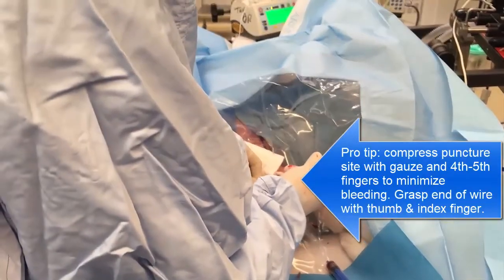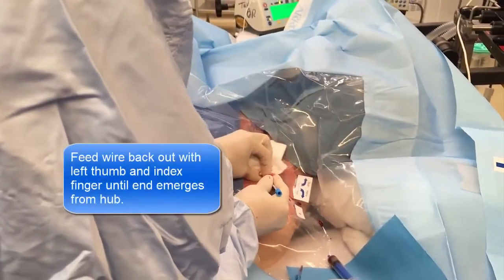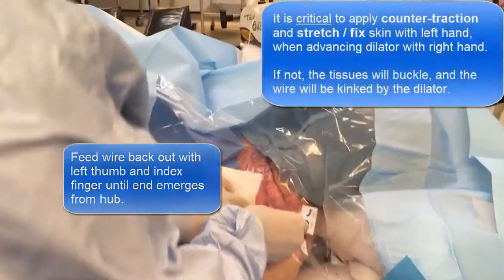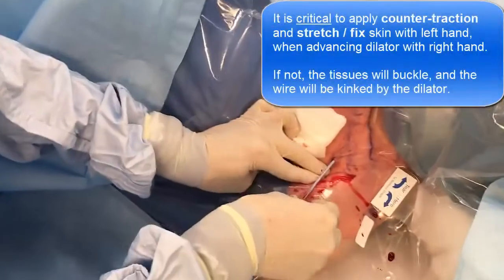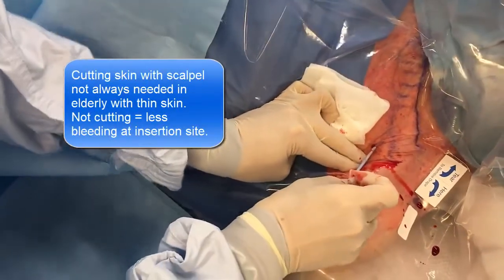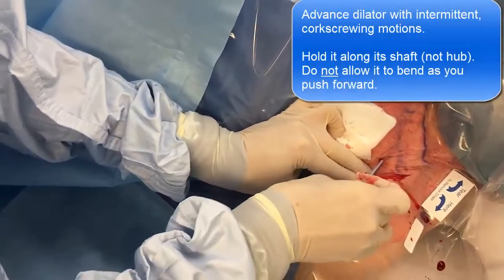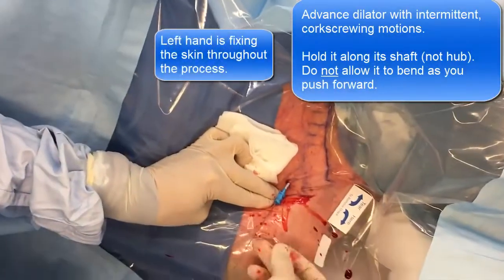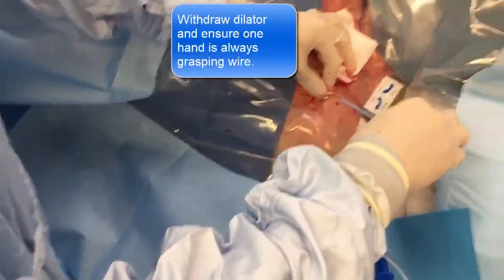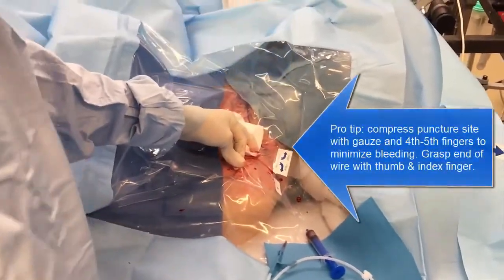The rest of it is just like any other central line. This is important — see how I stretch the skin. I'm actually not going to cut his skin because he's got such loose skin, but you actually — remember talking about stretching? See how counter-traction works — and then I push this. All the time they've got a wire. So that's why I was talking in the lounge about counter-traction — that's what that is.